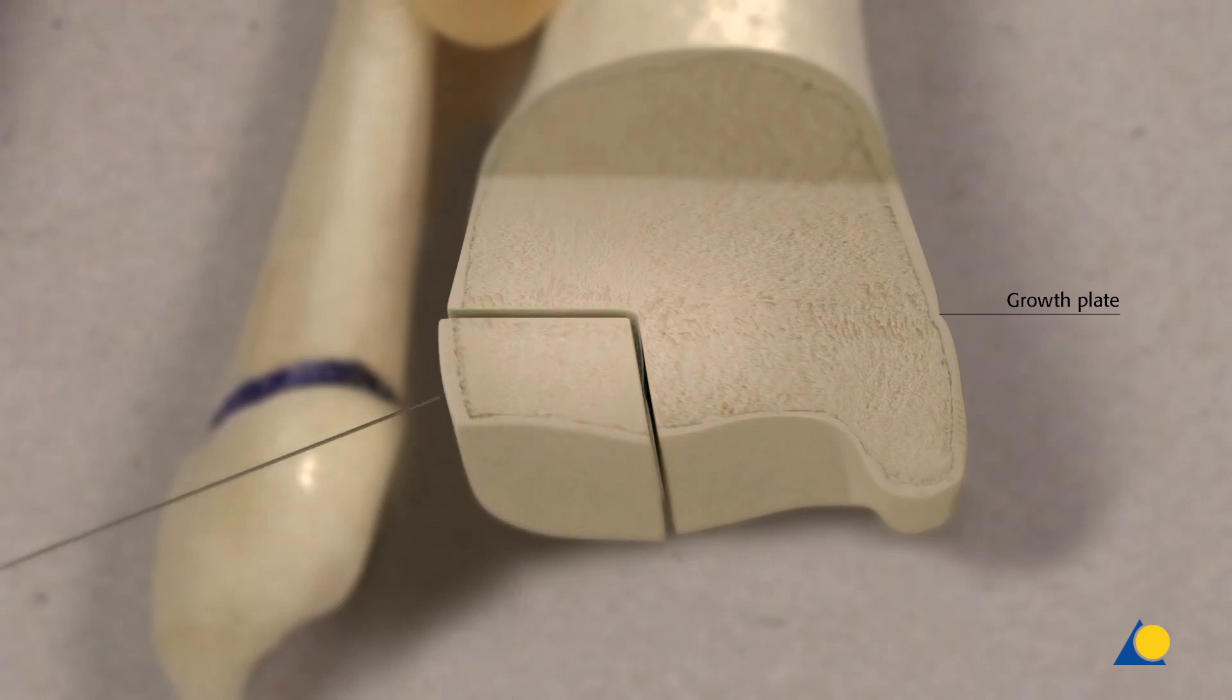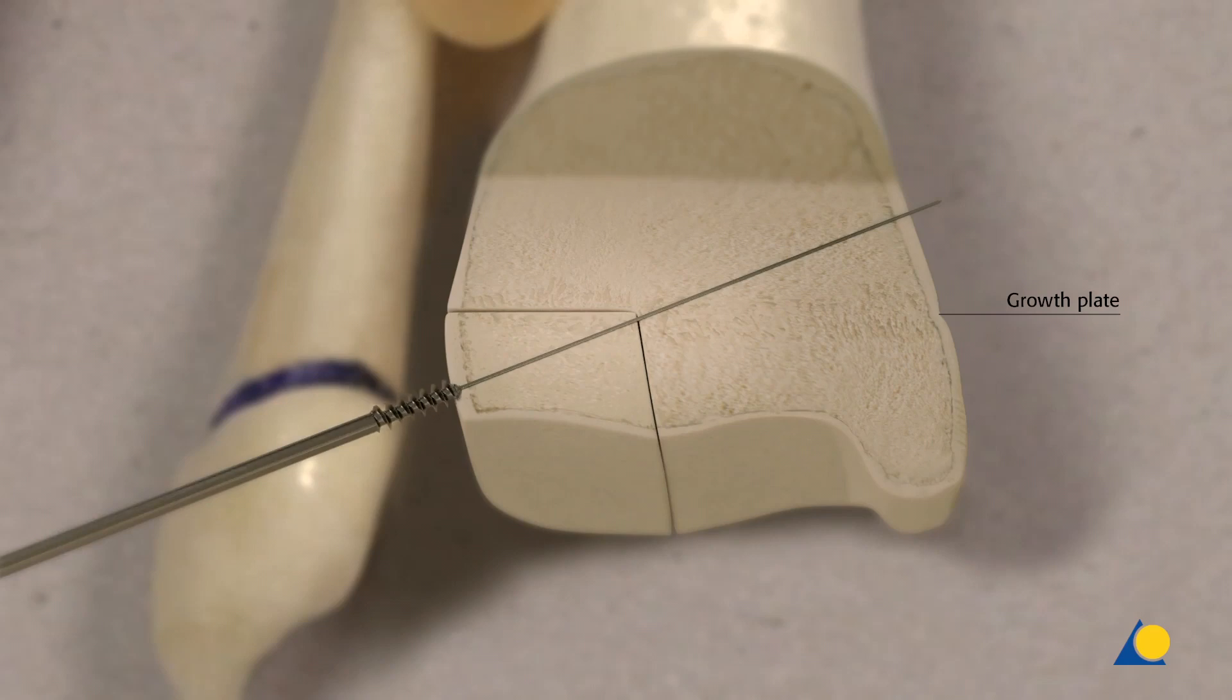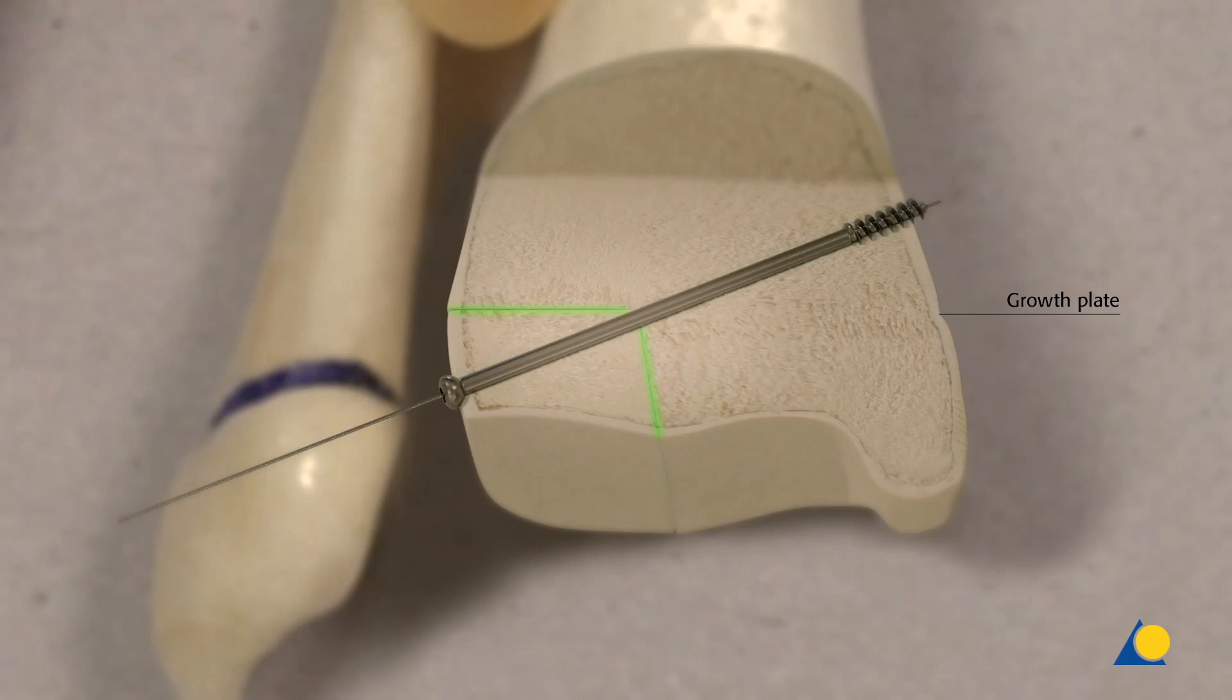An oblique screw technique will stabilize, reduce, compress and fix the fracture. The biomechanical principle of this technique is the vector geometry. The forces should be resolved correctly to avoid a step in the joint. The articular surface of the joint and the physis is reduced without displacement.